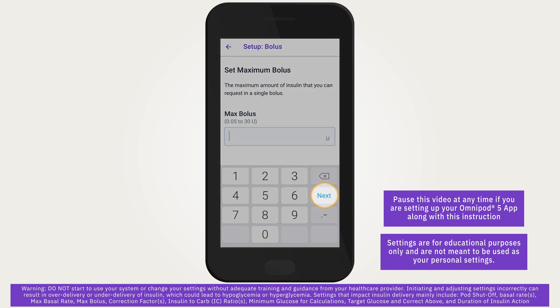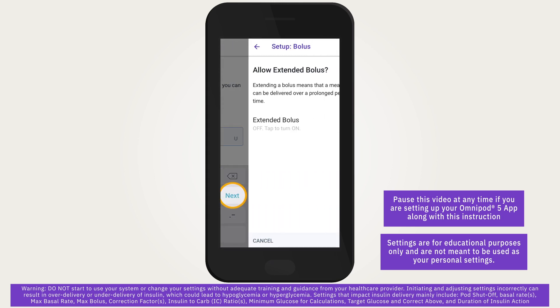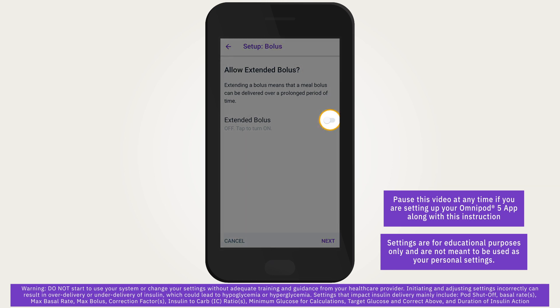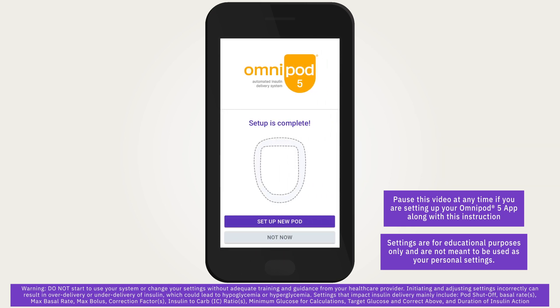Extending a bolus means that a meal bolus can be delivered over a desired period of time. This can be helpful with certain types of meals. Extended bolus can only be used in manual mode. Toggle the extended bolus button to turn the feature on if needed, then tap next. Setup is now complete.